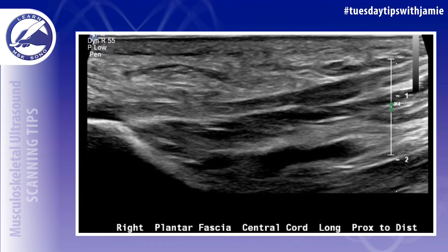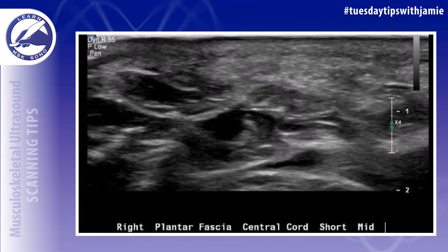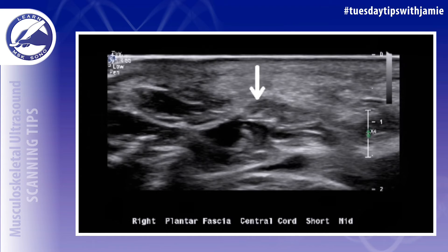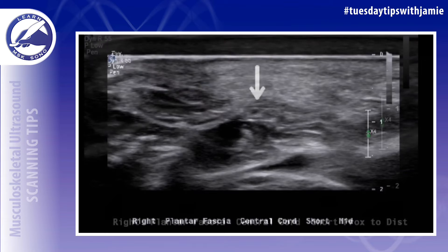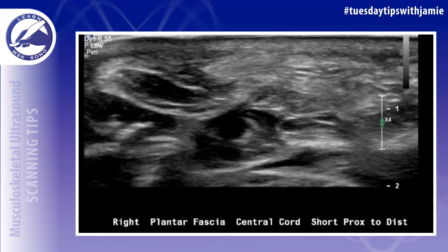How can you detect a tiny tear in a tendon or ligament on your ultrasound images? Here are a few tips. One, look for a focal disruption or loss of fibers. The tendon or ligament fibers may appear focally hypoechoic but still may be intact.